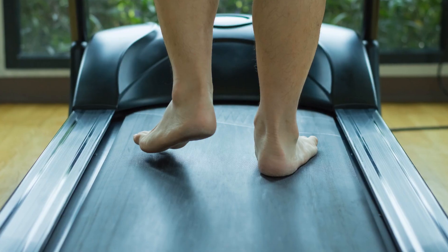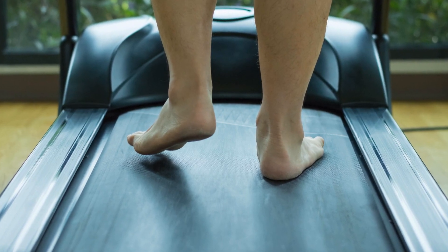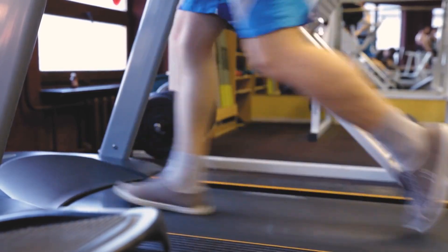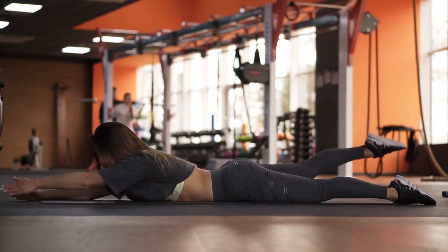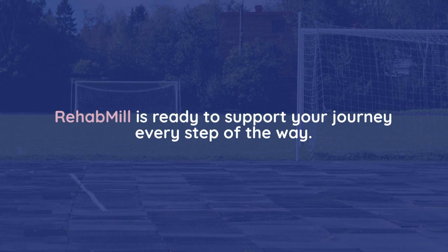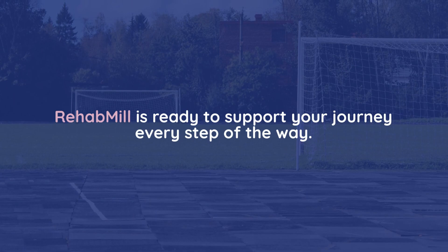In conclusion, the HCI Fitness RTM Rehab Mill is a significant investment in your health, offering both rehabilitation support and the capabilities for a rigorous workout. While it may not be the cheapest option on the market, its robust construction and versatile features make it a valuable addition to any fitness regimen. Whether you're recovering from an injury or pushing your limits, the Rehab Mill is ready to support your journey every step of the way.